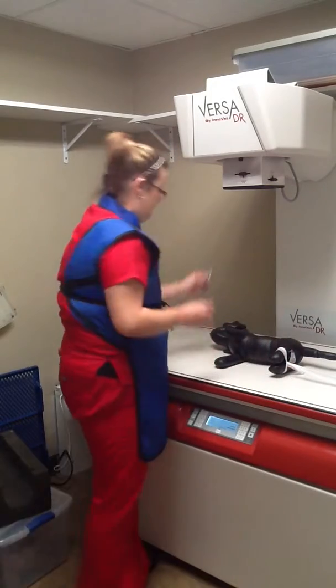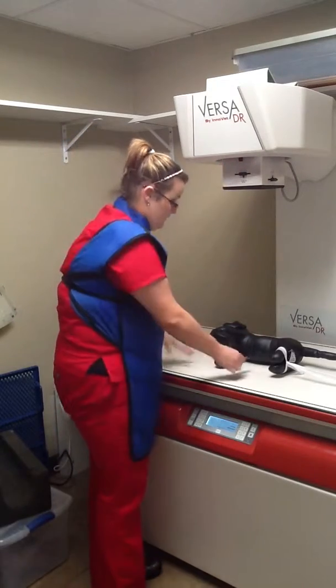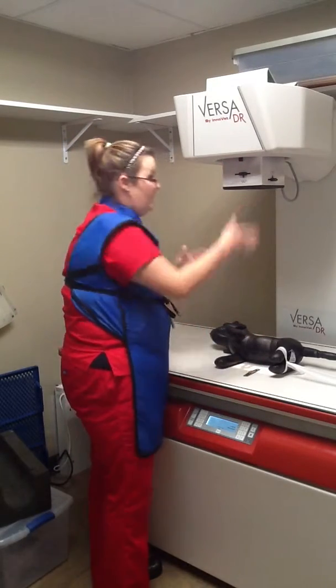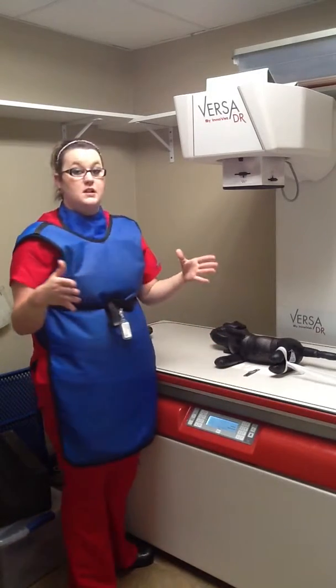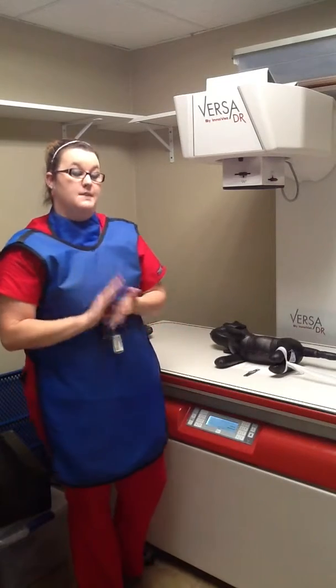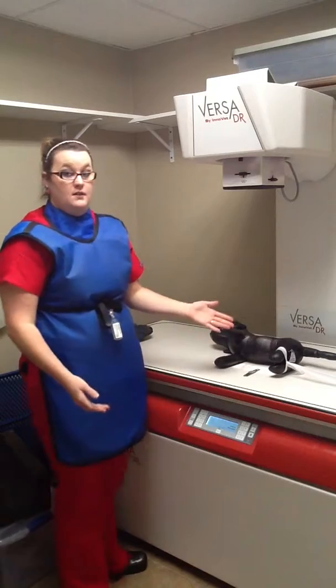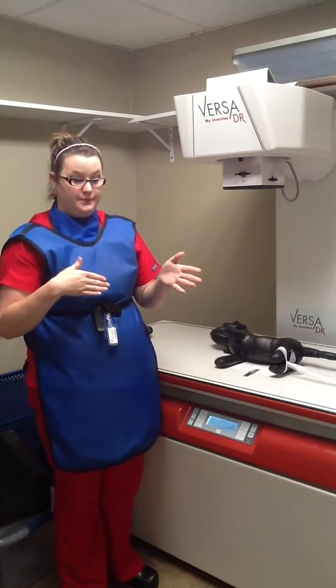And this is the marker you would use. You got your left and your right. My patient is right side down, so I would make sure the R is in way of the beam. And then in an older machine, like I was saying, you have your different cassettes. If you're using a small, medium, or large, it is a certain size, and you would insert the cassette and you would calibrate it to what you're needing of the patient.